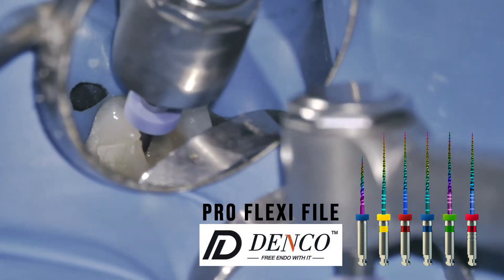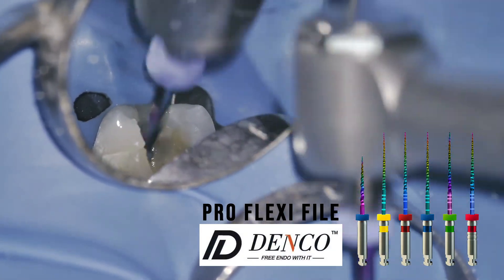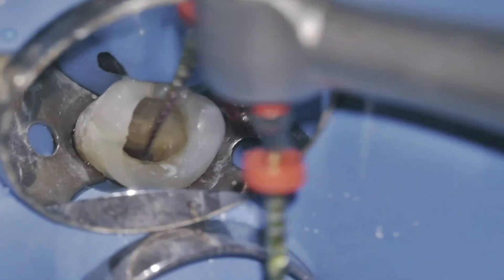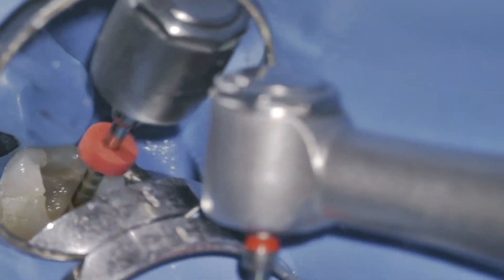For this case, I'm using the Denco Pro FlexiFile system, which provides excellent flexibility and cutting efficiency. I start with the K-File number 10 to establish patency and proceed with the rotary file to achieve the designed canal shape.